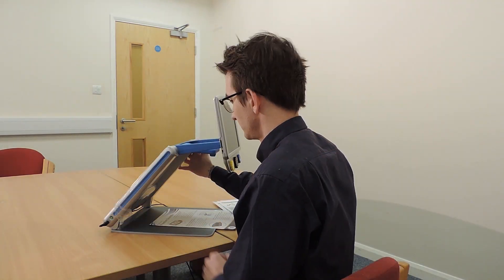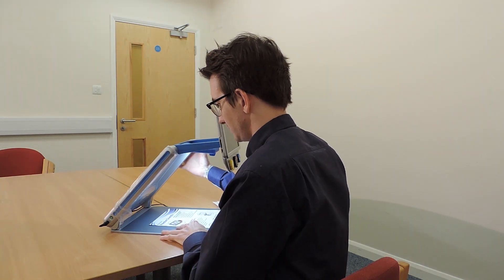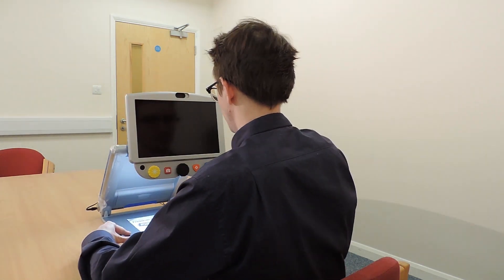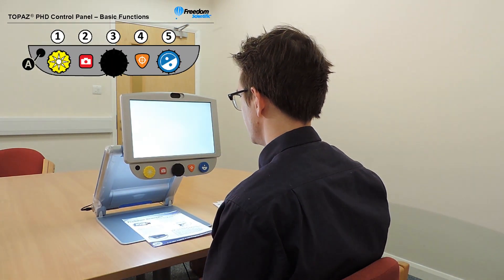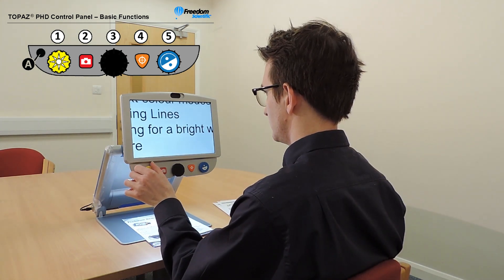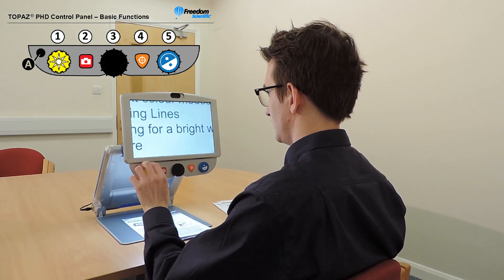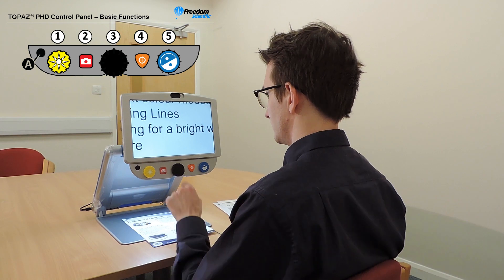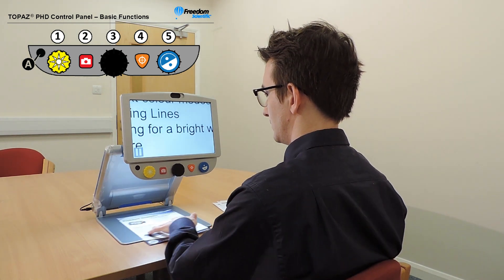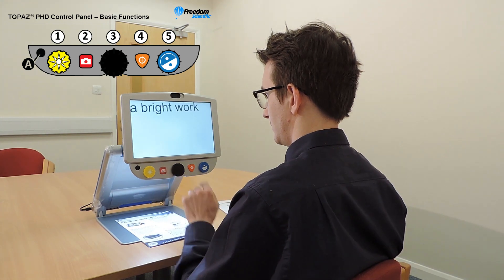Let's explore some of the main features of the Topaz PHD together. To turn the unit on, press the power button located on the left side at the bottom. On the left side of the control panel there's a yellow brightness dial — turn it clockwise or counterclockwise to increase or decrease the screen brightness. Use the red freeze frame button to freeze an image displayed on the screen; press it again to return to the normal live view.